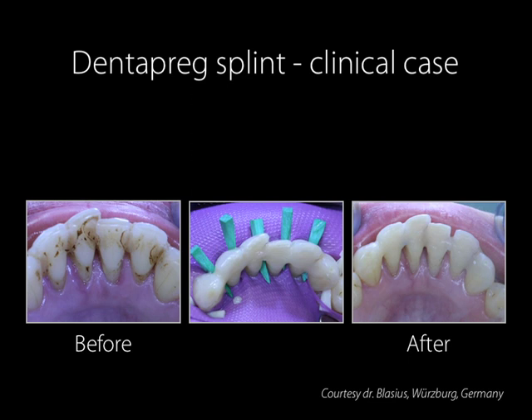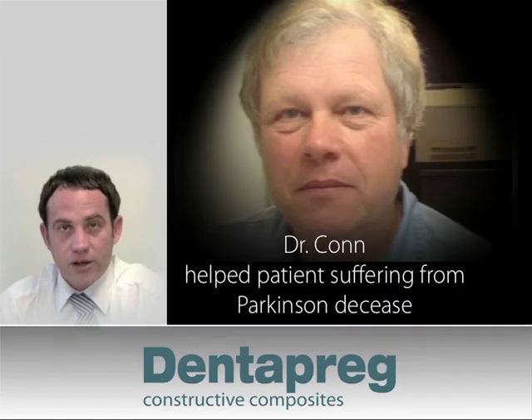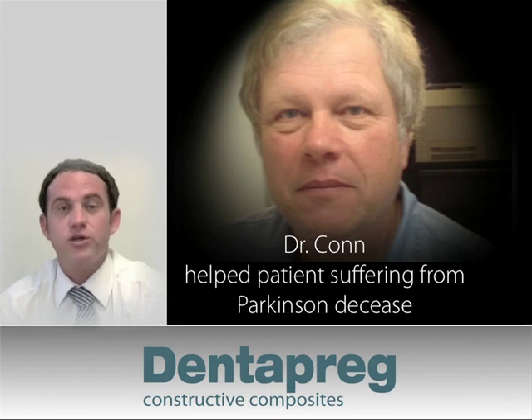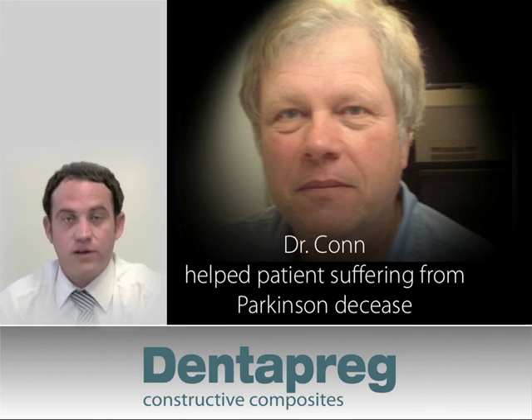In the final picture, we can see the final splint. Notice that with the Dentopreg strip and a fine layer of flowable composite, the splint is hardly recognizable, and how this would compare aesthetically with a similar metal splint. As a final thought, we would like to end this webinar with an actual success story told to us by Dr. Kahn of Danville, Illinois.